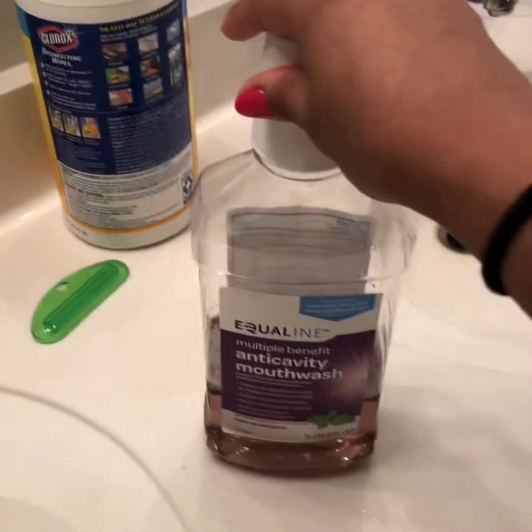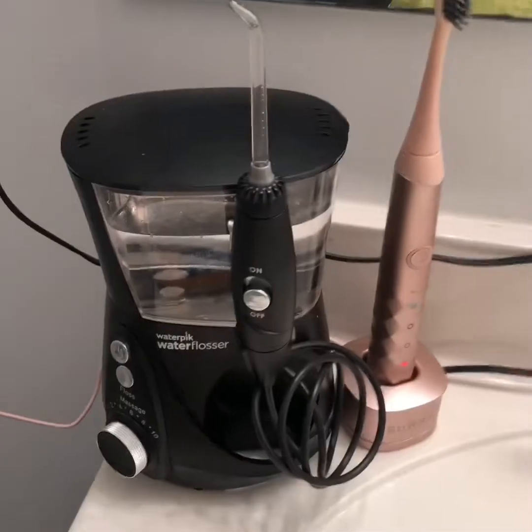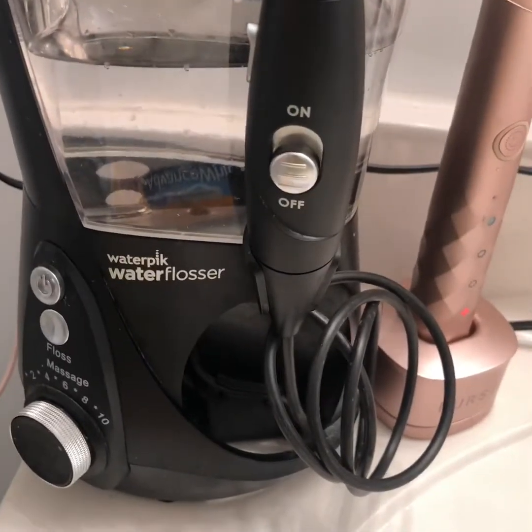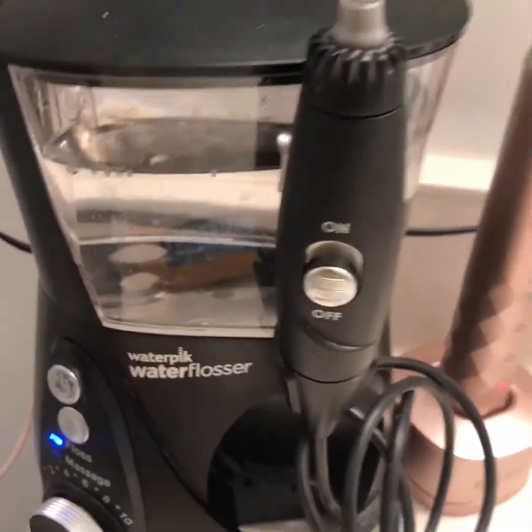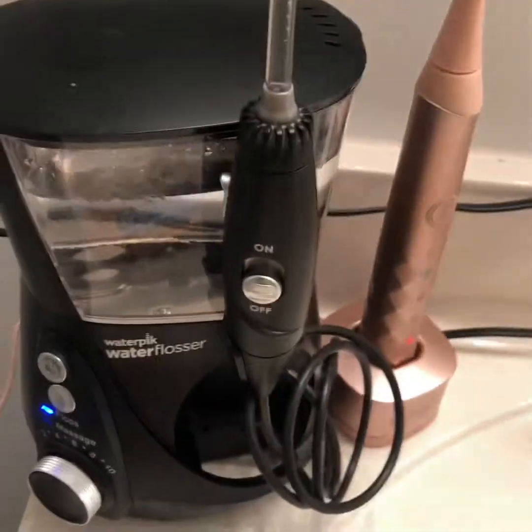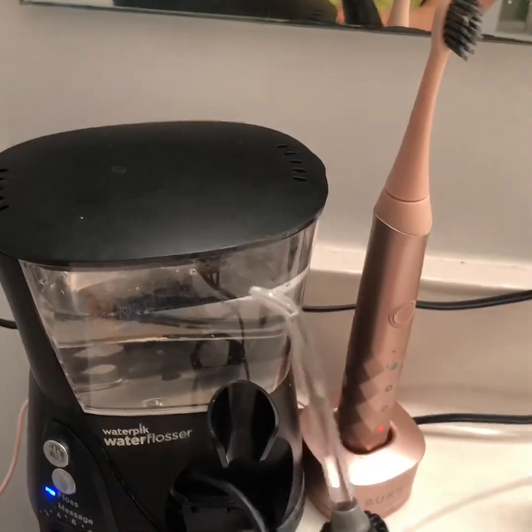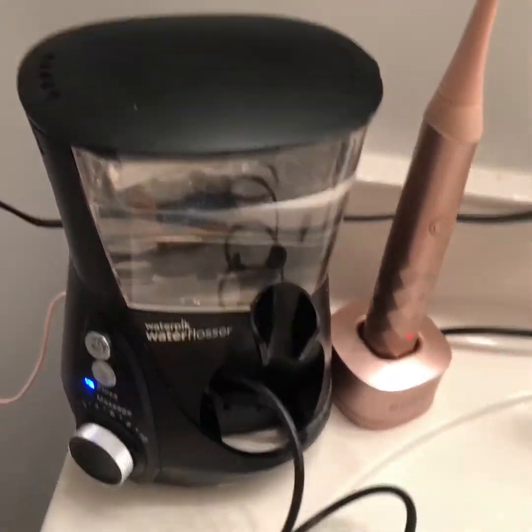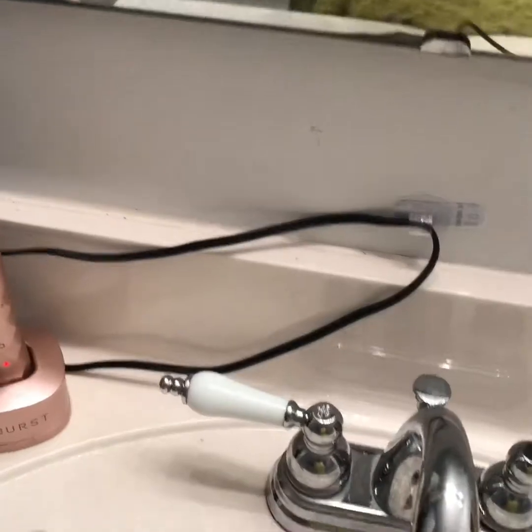Mouthwash is in the water reservoir — the water reservoir is filled with warm water. I'm gonna go ahead and turn it on. The beauty of this model is that unless I hit the on button it's not gonna shoot water at me. This is a water pick water flosser, the Aquarius.